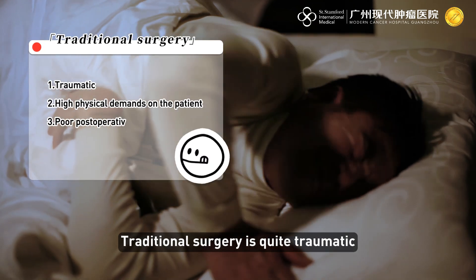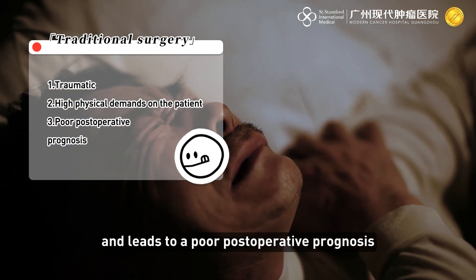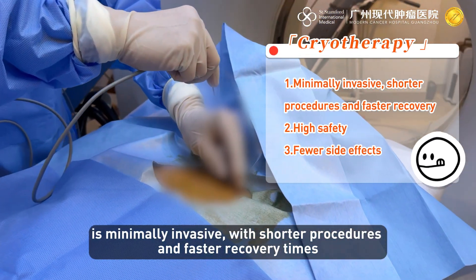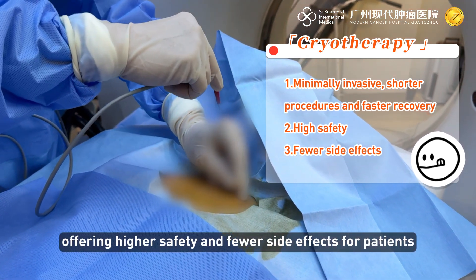Traditional surgery is quite traumatic, demands great physical fitness from the patient, and leads to a poor postoperative prognosis. Cryotherapy, by contrast, is minimally invasive with shorter procedures and faster recovery times, offering higher safety and fewer side effects for patients.